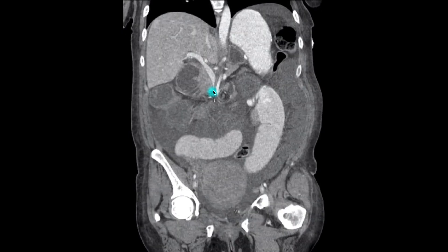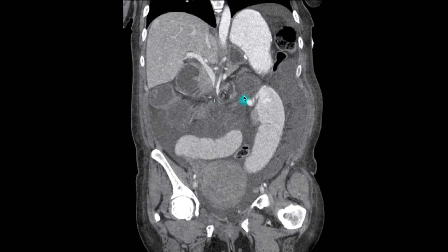Moving anteriorly, we see the swirl sign, which indicates the location of the mesenteric defect of the internal hernia.